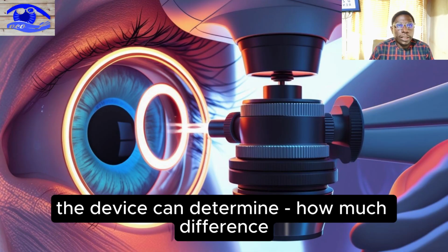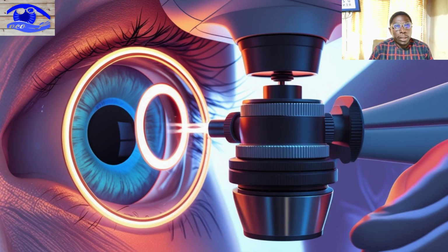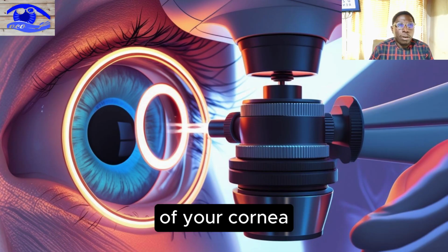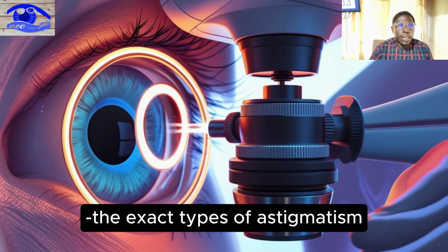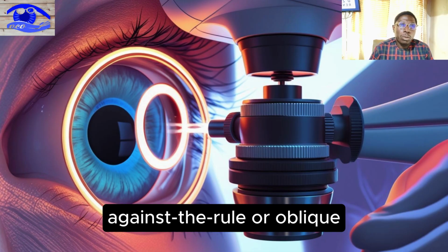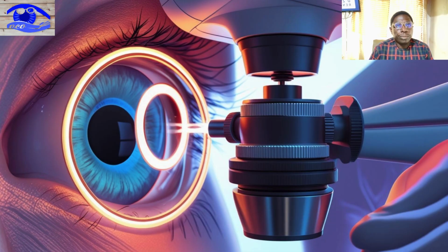The device can determine how much difference there is between the steepest and flattest meridians of your cornea. It identifies the exact type of astigmatism, whether it's with the rule, against the rule, or oblique.